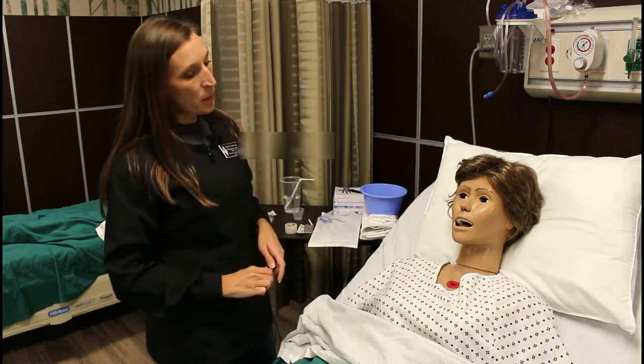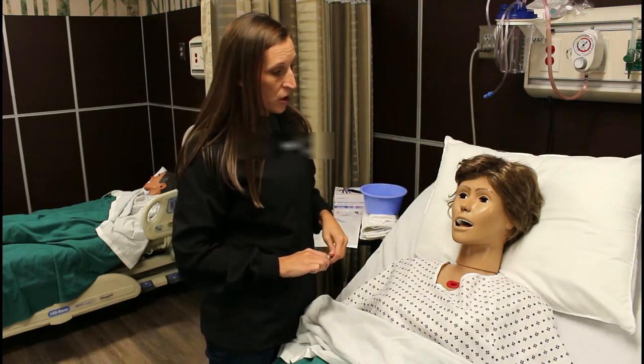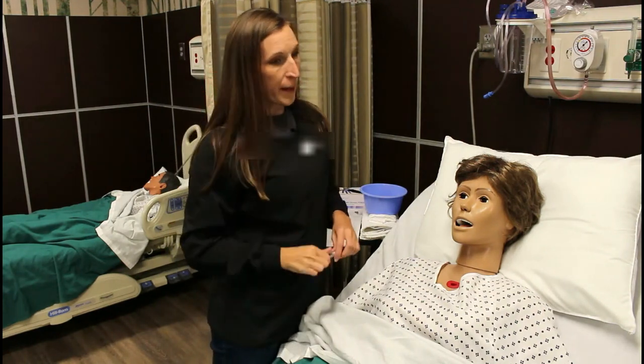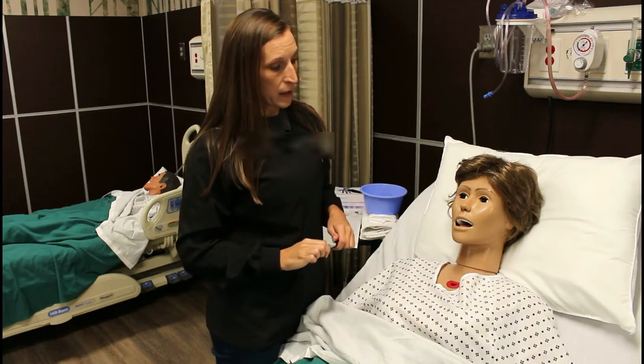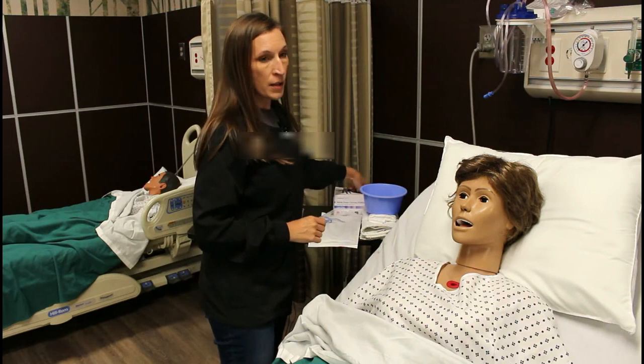Now, if at any time during the procedure you feel uncomfortable, or if you're in any pain or discomfort and you need me to pause, just raise your hand as a hand signal to let me know to pause and give you a break. I'm going to put on some non-sterile gloves.